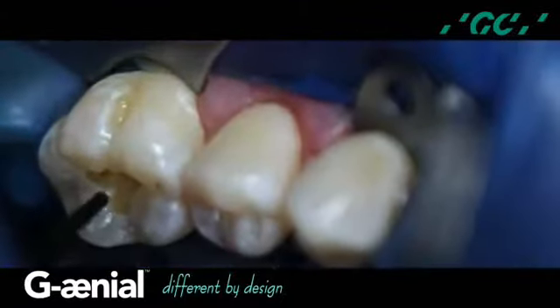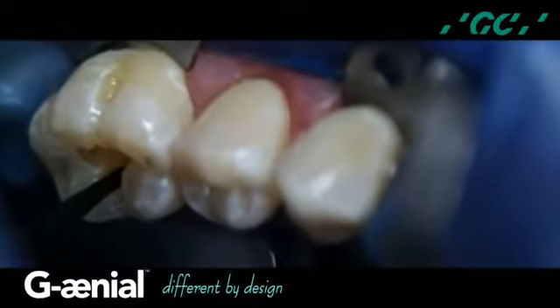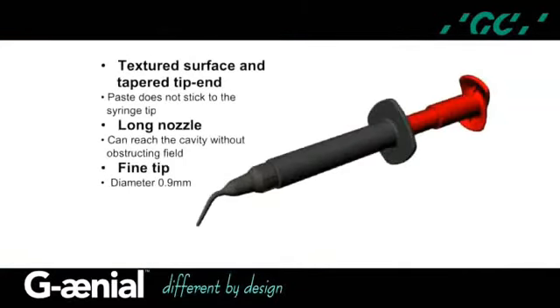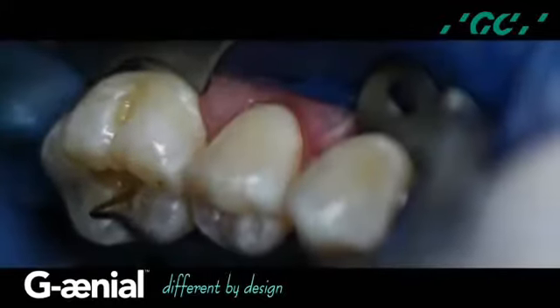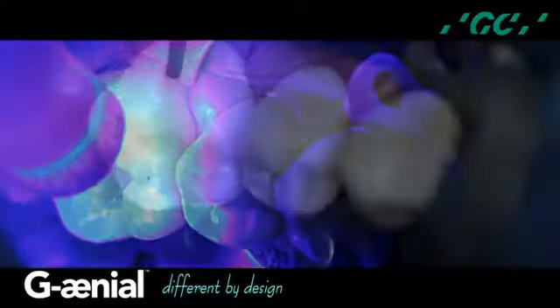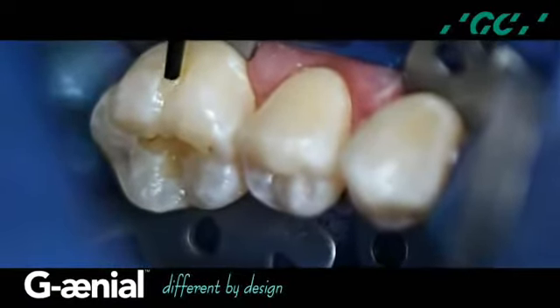A second increment of A3 shaded G-aenial universal flow is applied using the syringe tip with an ergonomic design to improve the access while maintaining visibility. Adapting the material with 1112 Explorer tip and light cure for 10 seconds. An increment of A2 shaded flowable is applied with the syringe tip.